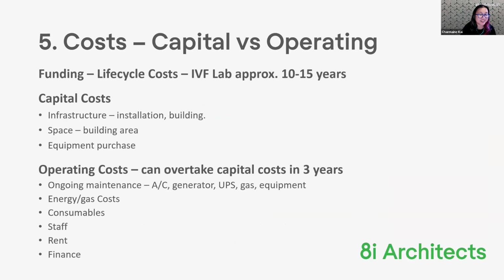So to cost all these things, there are costs in terms of building new facilities. So funding is really important, and think about the life cycle costs. When you're talking to whoever's funding the labs and the hospitals, think about it over the term of 10 to 15 years, because that's the life of your lab. The capital investment is usually quite large, but if you spread it out over 10 to 15 years, for a lot of financiers, it's a much more palatable equation. So something worth thinking about there.